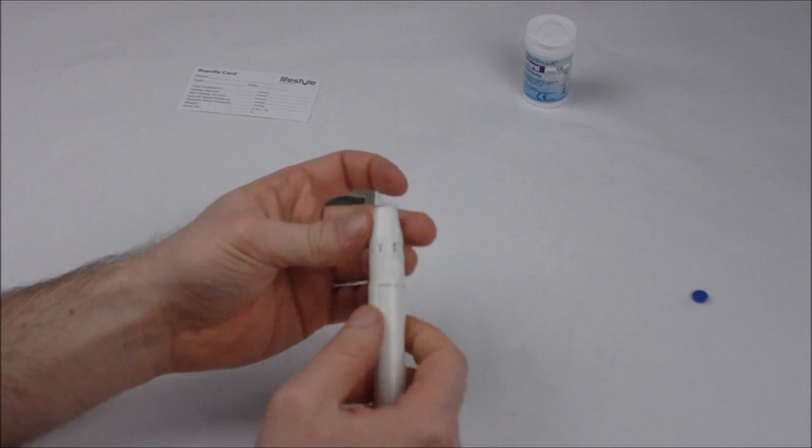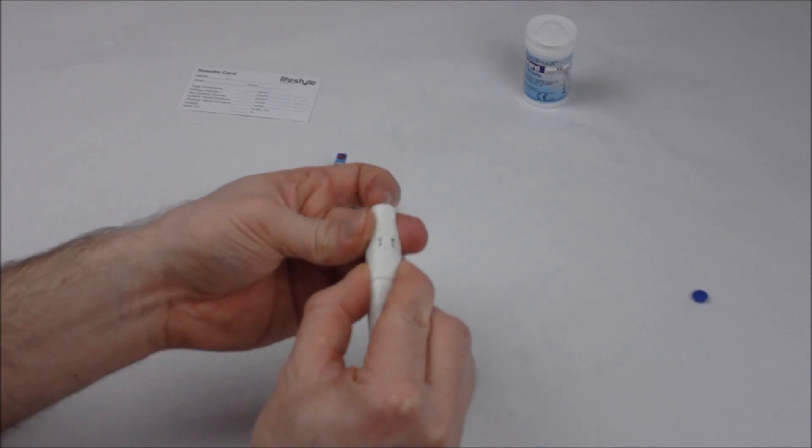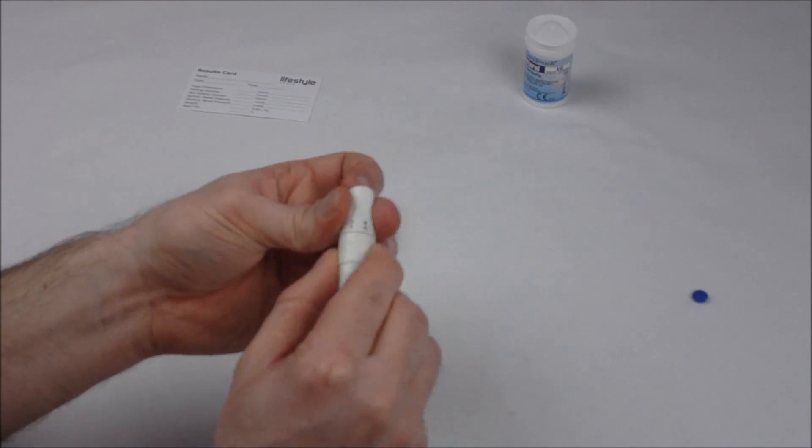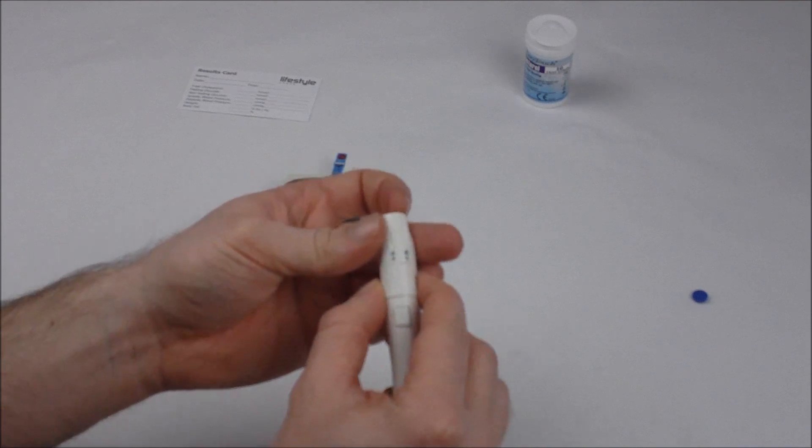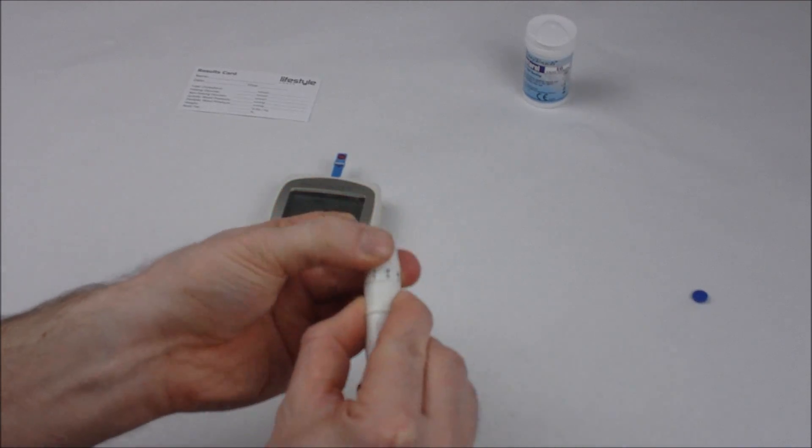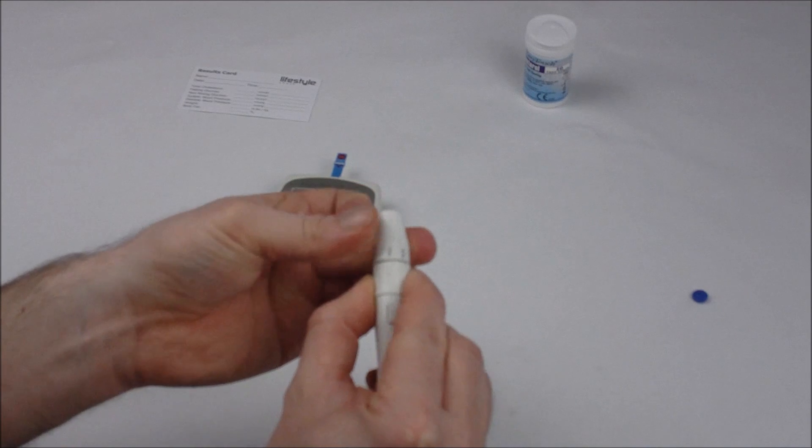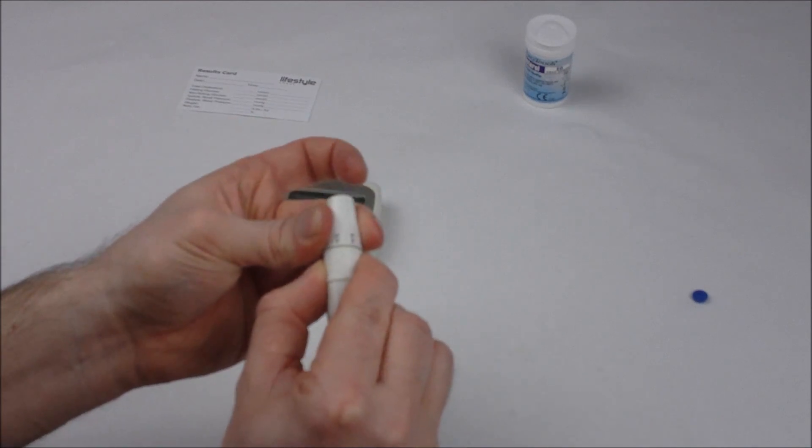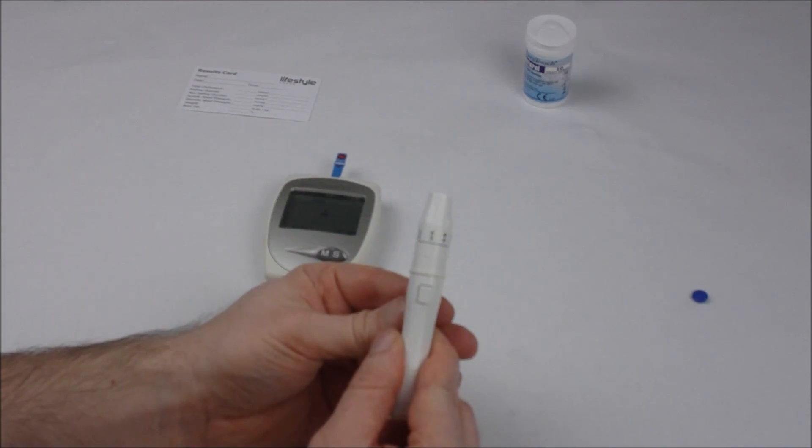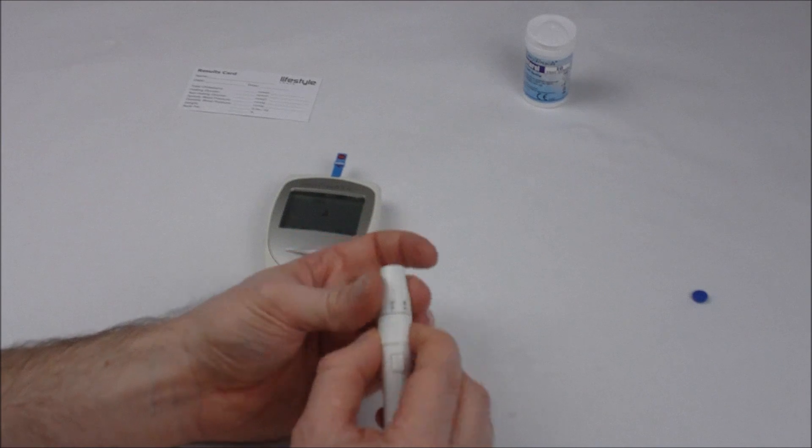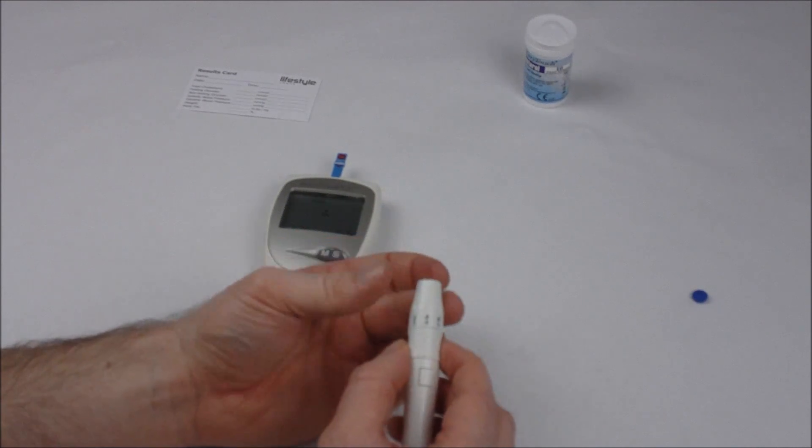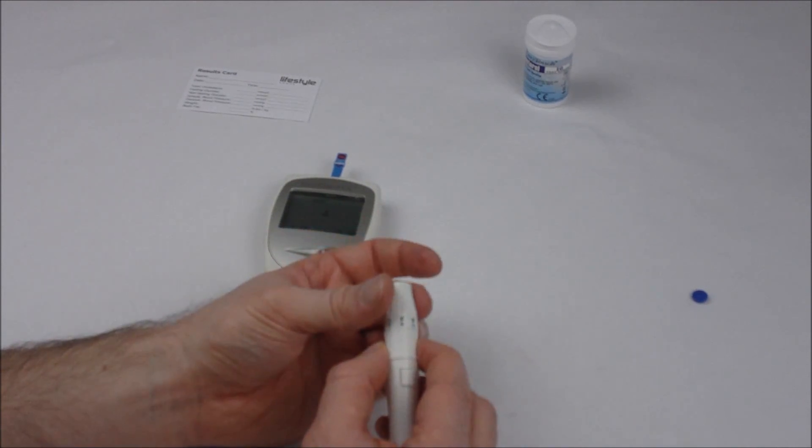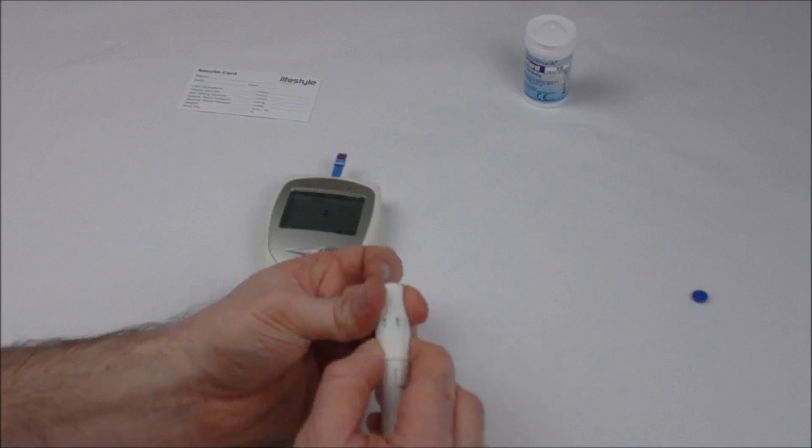Choose the depth setting that corresponds to your skin depth. Calloused fingers or thicker skin needs a four or five setting, thinner delicate fingers one or two. I recommend starting at three in the middle if you're unsure. For me I know that four is the best, and because I need a bigger blood sample I'm going to go to a setting of five.